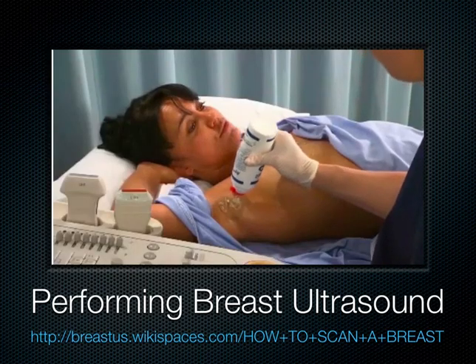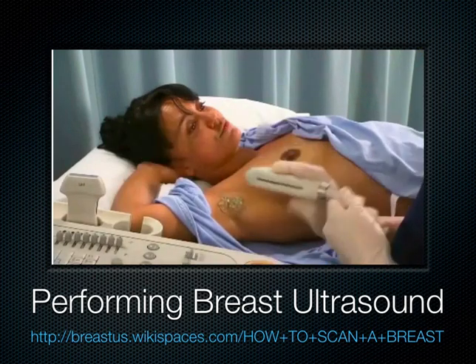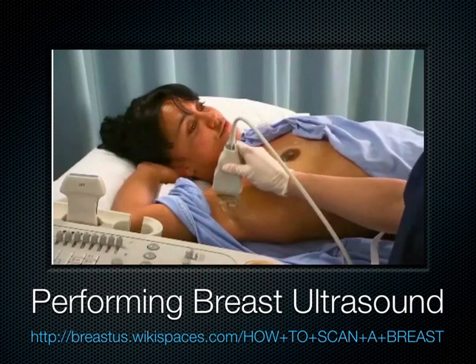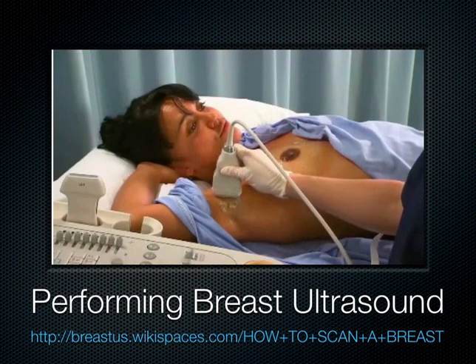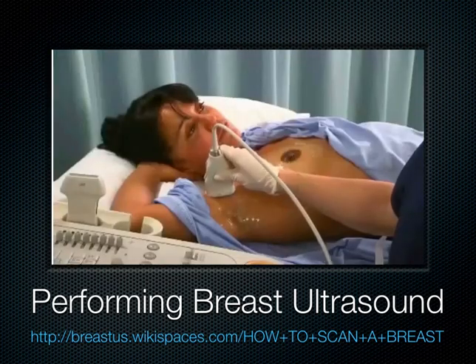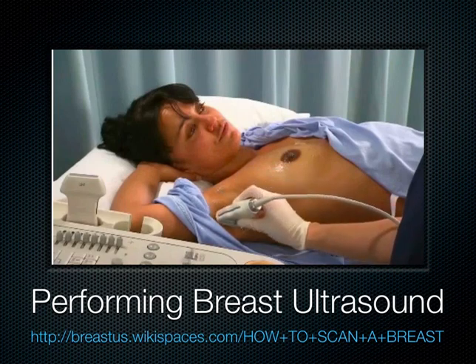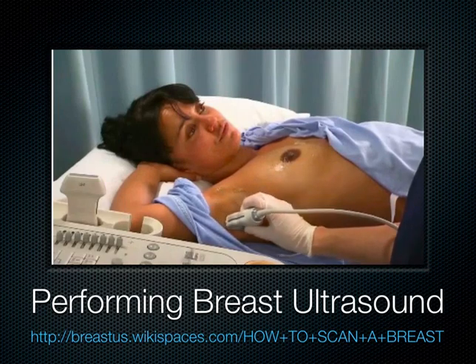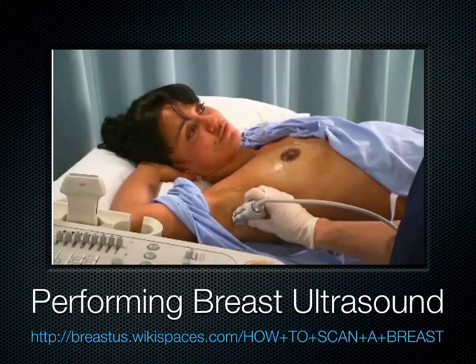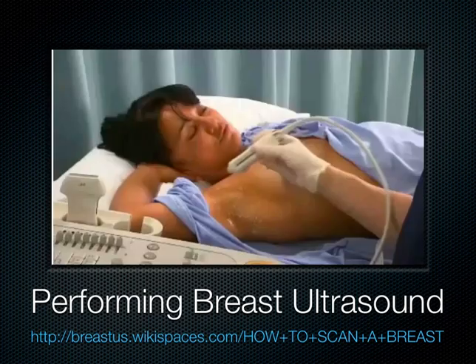Apply gel to the right axilla. To scan the axilla, place the transducer in the longitudinal plane of the superomedial aspect of the axilla with the notch pointing superiorly. Using a grid technique, slide the transducer horizontally towards the superolateral aspect. Then slide it inferiorly to the inferolateral and finally to the inferomedial aspects of the axilla.